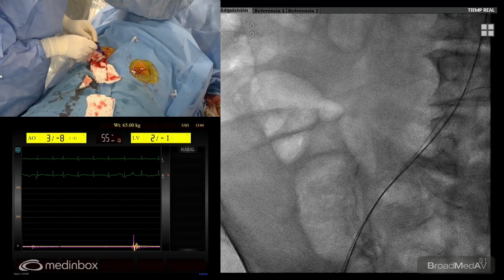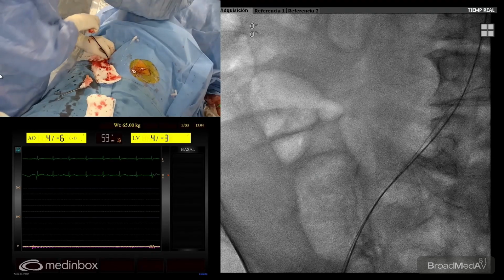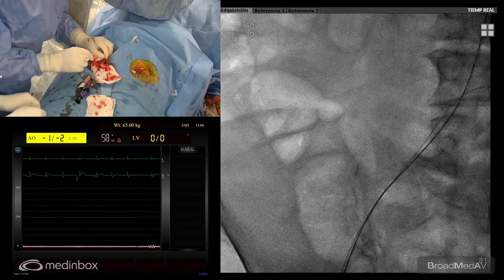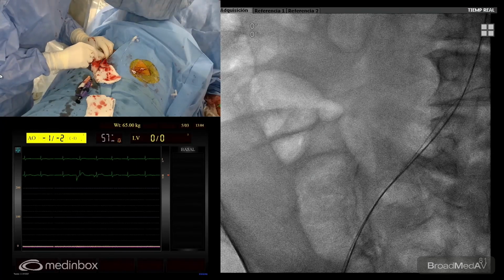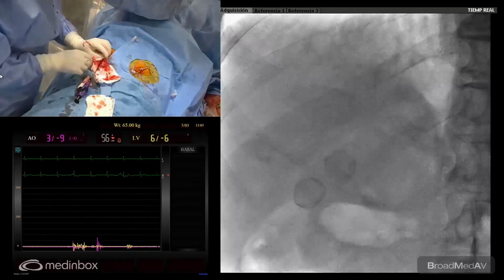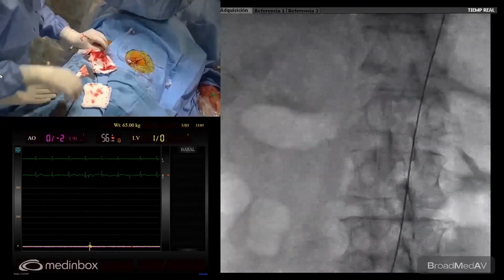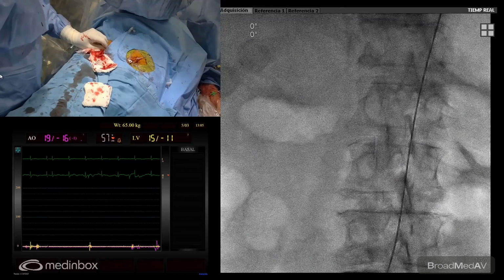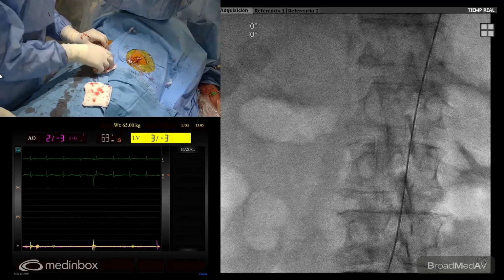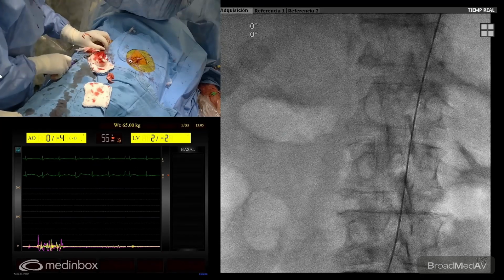So now we are in, we have a good flow of blood. Okay, yeah, okay. Something went wrong here. We might need another ProGlide. Probably due to the calcium. I don't know if we are going to use another ProGlide or the ProStar, because this calcium, I think, is interfering. Because I have a problem when retrieving.